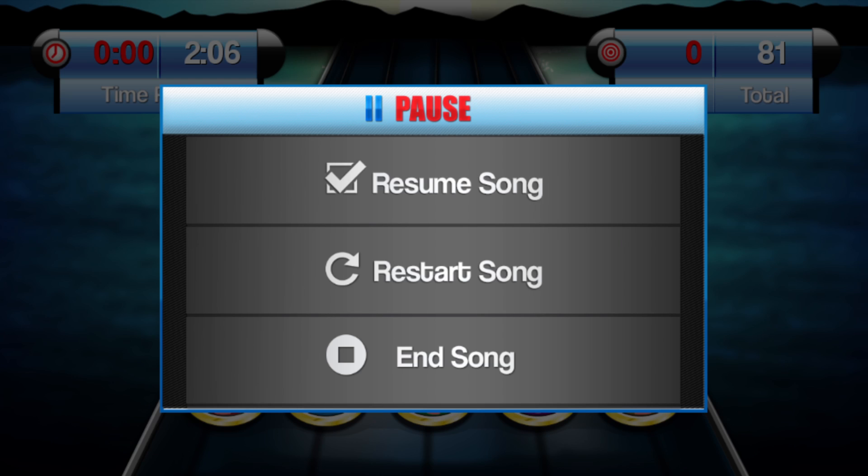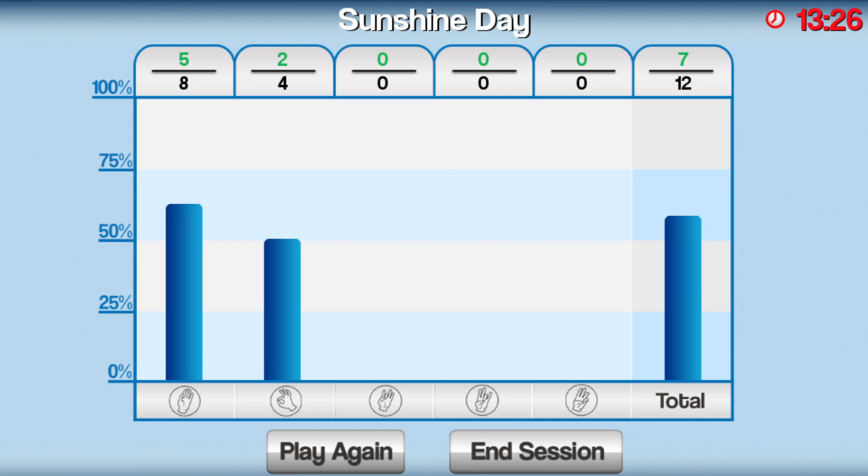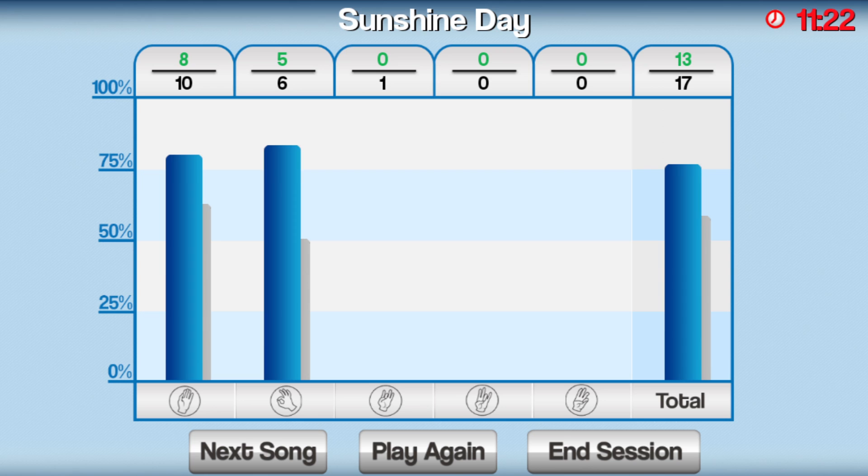Touch the screen to pause the game. In this menu, you can restart the song or end the song early. After a song has completed, your performance for each individual grip and total performance is displayed. Select Play Again to repeat the previous song. After you play the song twice, grey bars will appear representing your performance on the previous try, and you will be able to select Next Song to go to the next song in the playlist.